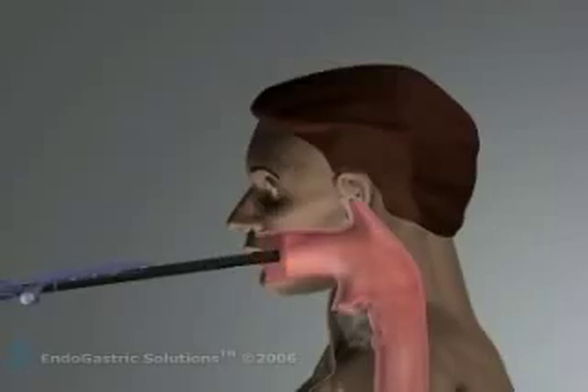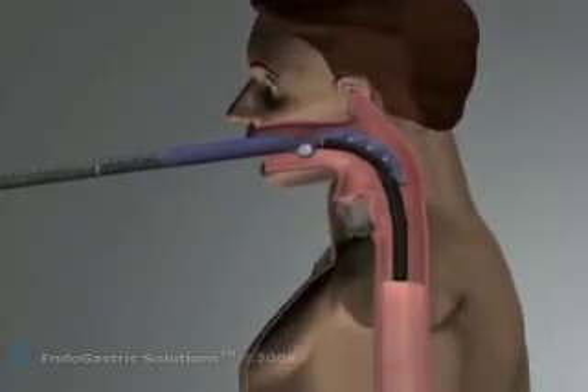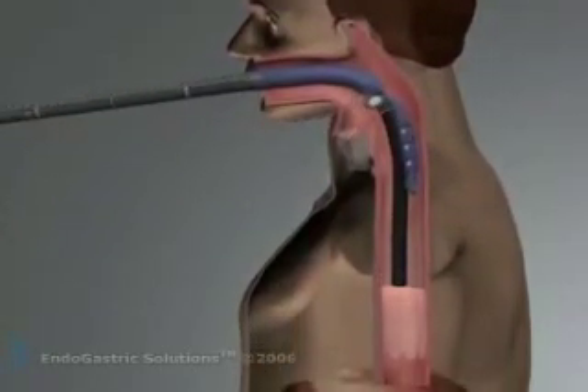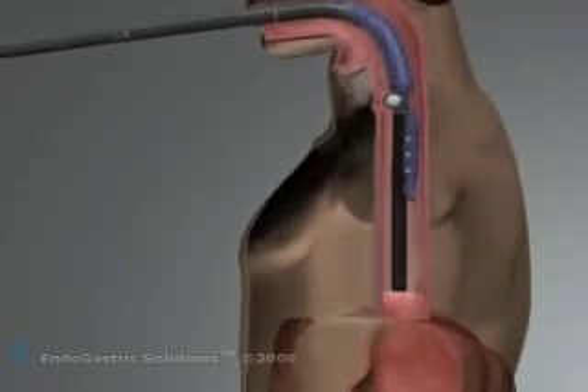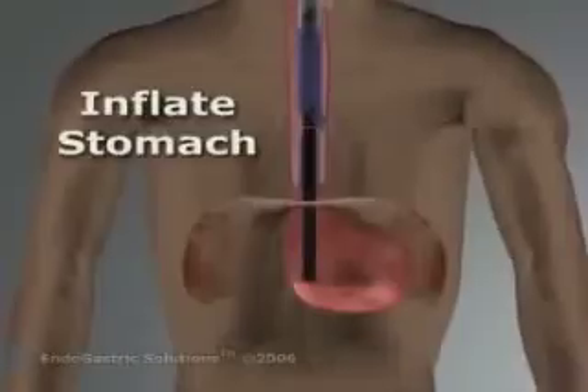The working end of the esophagus device is a complex 7-lumen instrument that enters the mouth of a patient riding over a standard endoscope. Under general anesthesia, a team composed of a surgeon and interventional gastroenterologist position the device for surgery.